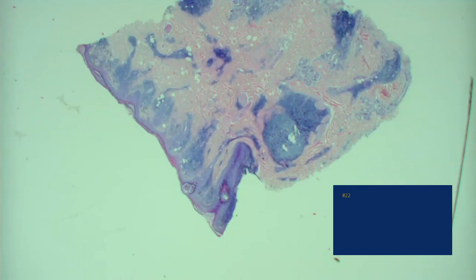Okay, this is a punch biopsy of non-acral skin. What stands out is the pattern of a superficial and deep inflammation, a lymphohistiocytic infiltrate. Some of it centered around eccrine glands and adnexa. And then also around some follicles. Also around the follicles. And there is some follicular plugging. Okay. And some evidence of interface changes as well. Pigment dropouts. I thought this was pretty good for DLE.